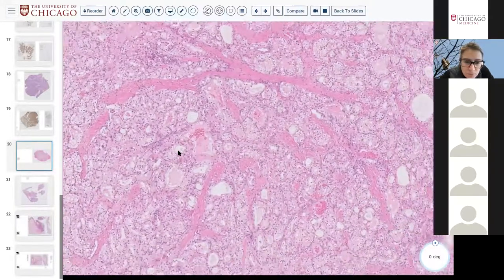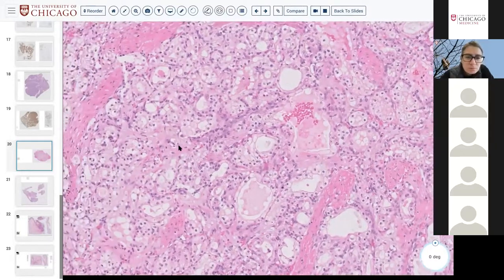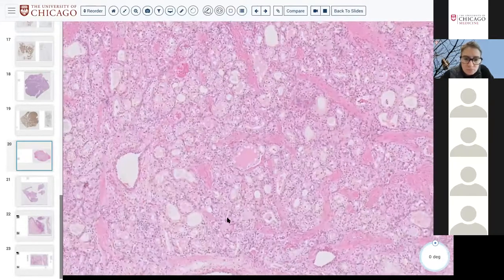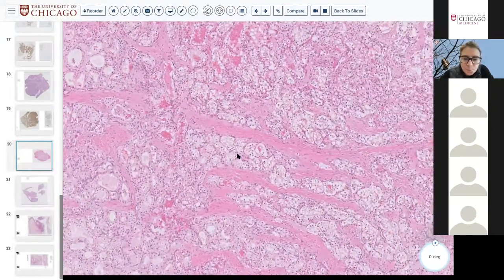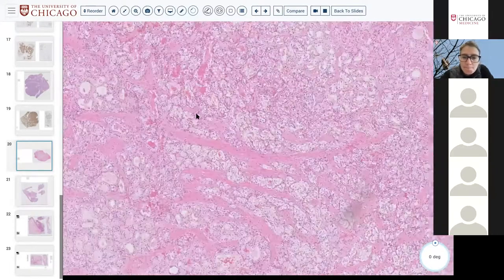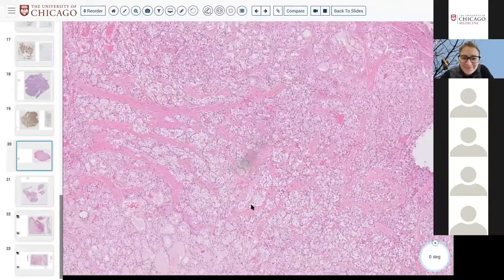It looks like some things you see in other places, like renal cell. So definitely a renal cell-like sinonasal adenocarcinoma comes to mind. Yeah, and here's some of the fibrous septations. And then that vascularity too, like you expect that as well. And you do see some of that vascularization.